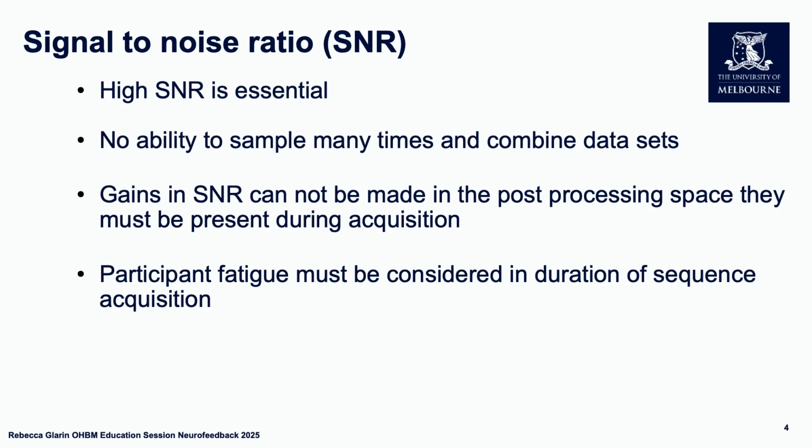Also to consider when you're designing your paradigm is that participants will fatigue. I think this was mentioned earlier as well. So you need a robust enough protocol or paradigm that participants can perform it for 10, 15 minutes and produce that feedback that is going to get you the post-processing results you need, but also enough activation in real time again. So these are really important considerations.